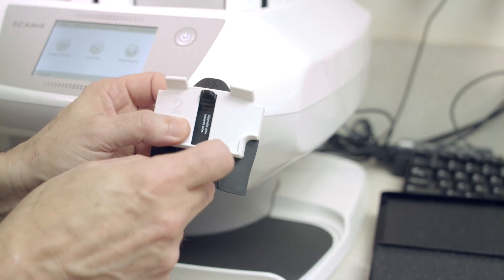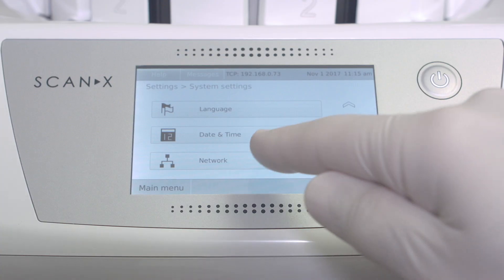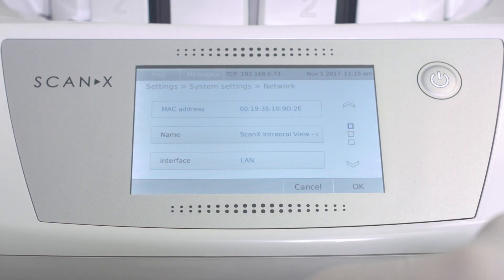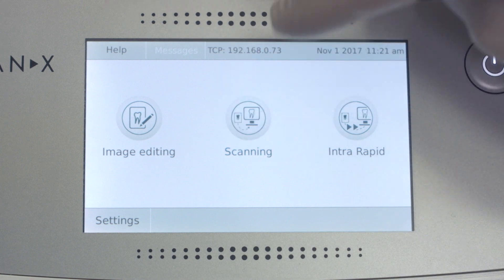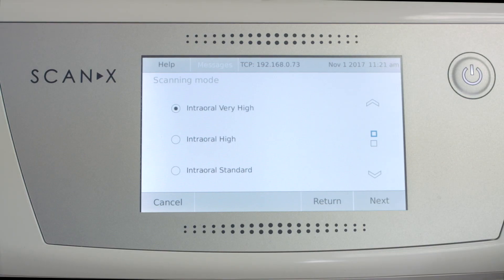The Scanex Intraoral View is wireless. It takes advantage of the Wi-Fi in your office, which allows you to put it anywhere you want. The machine is very easy to operate and comes with a nice touchscreen, making it simple.